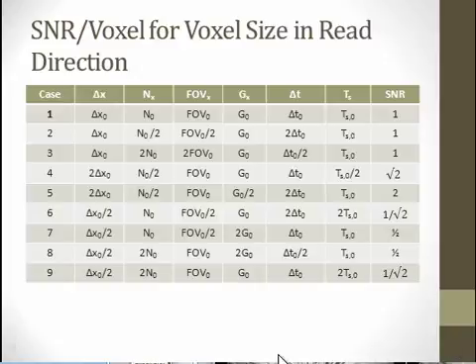So a few different cases here to show how the SNR is changing, or how you can change the SNR by changing certain read direction parameters.